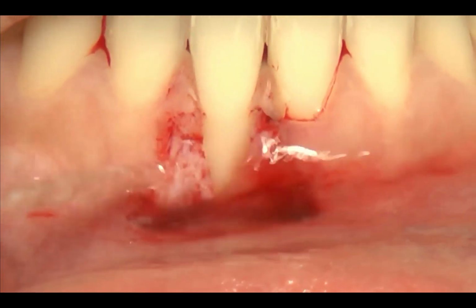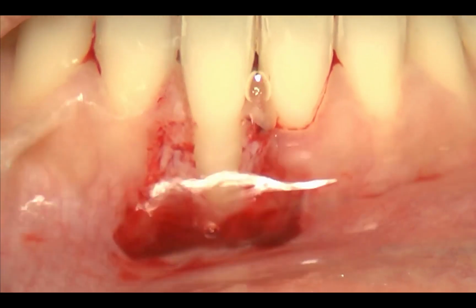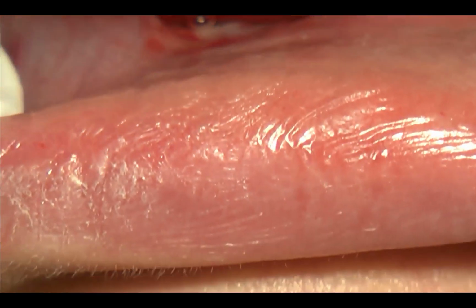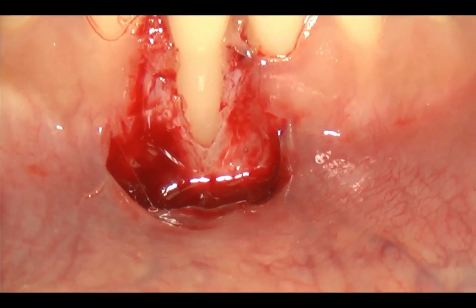You have to rinse with saline a lot in order to remove completely the EDTA gel from the dentin tubuli. And now you can see a very nice wound area with a good control of the bleeding, both at the level of the papilla and at the level of the surface.